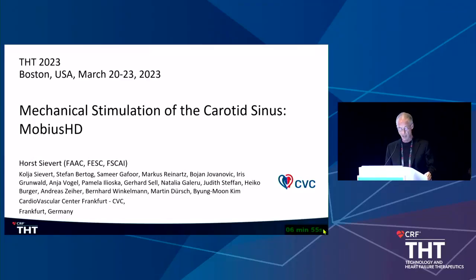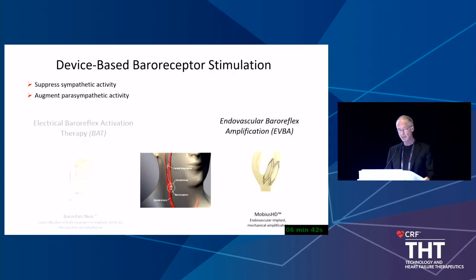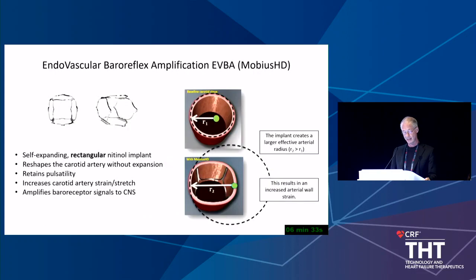Thank you very much. You have heard about electrical baroreflex activation, and you have seen the results in one of the prior talks. We are doing the same, but using a mechanical implant, which is implanted into the carotid bulb. So it does not need a battery. It does not have to be replaced. It stays there forever, basically.